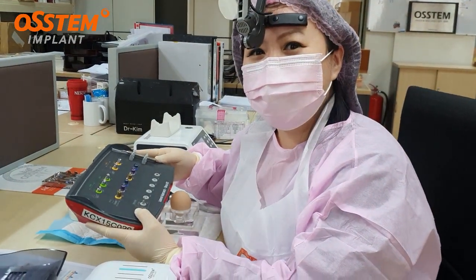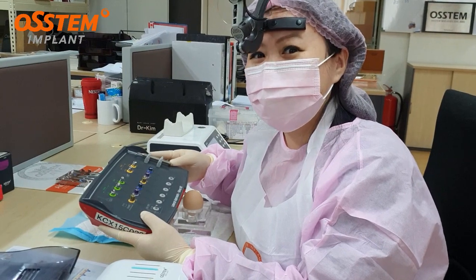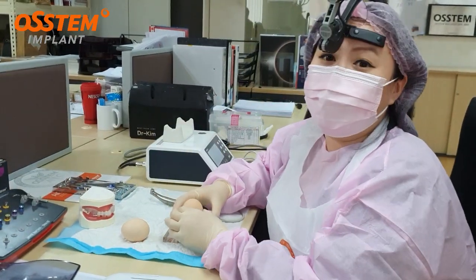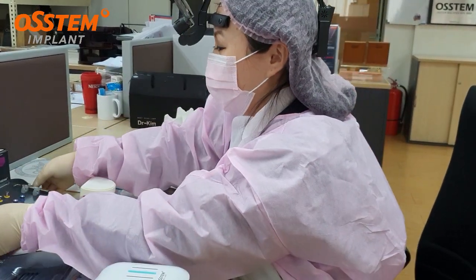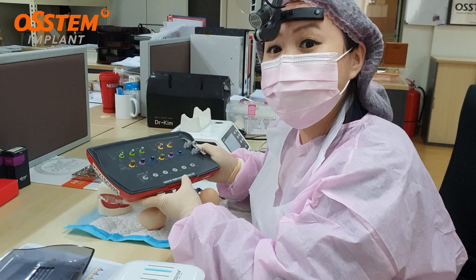Hi guys, I'm Dr. Ilin Lin from Malaysia. Today I'm going to show you the Allstamp lateral sinus kit. I'm going to do a demo on the egg that we prepared. Basically, the kit is a lateral approach sinus kit.